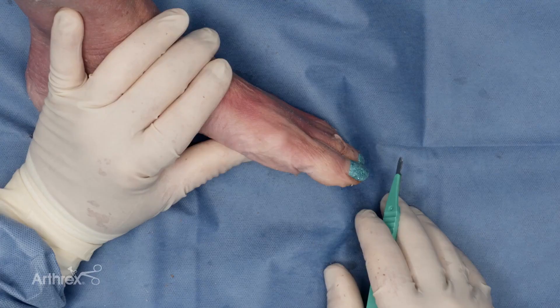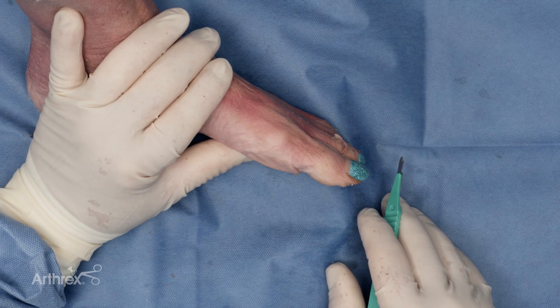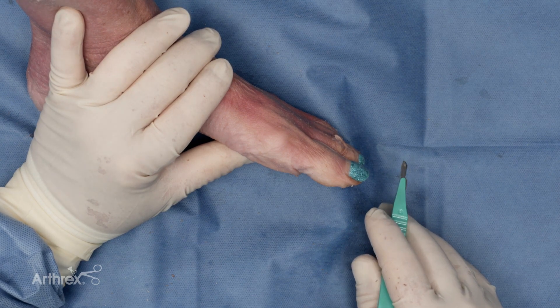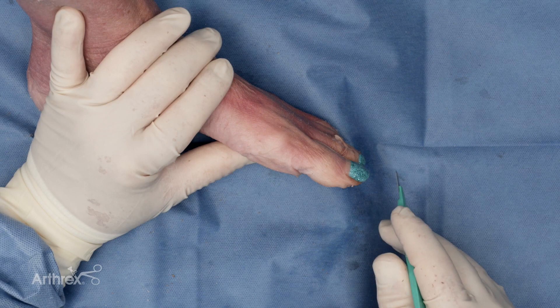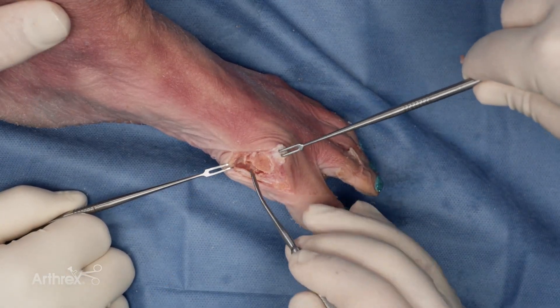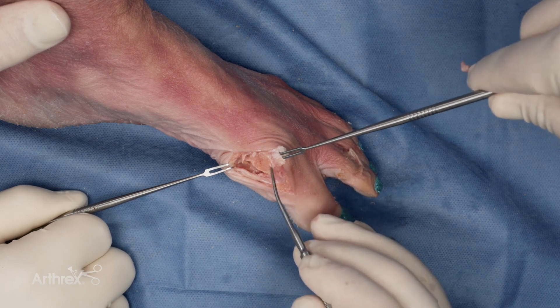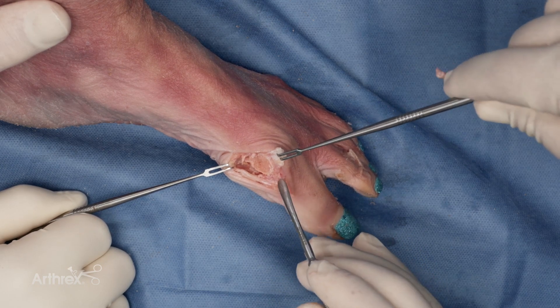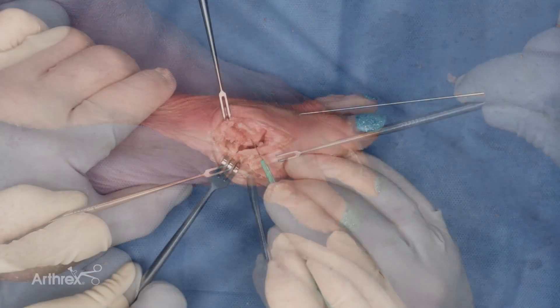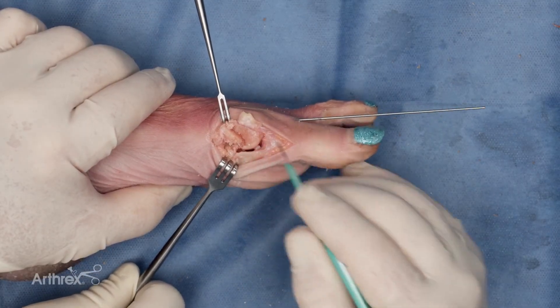Another indication for this snap-off implant is a distal metatarsal osteotomy for bunion corrections — such as a chevron — which is another useful application for the snap-off pin. The medial eminence has been exposed following a capsulotomy. Care is taken to avoid excessive stripping of the metatarsal head. A chevron-shaped osteotomy will now be performed. The osteotomy has been completed and translated.